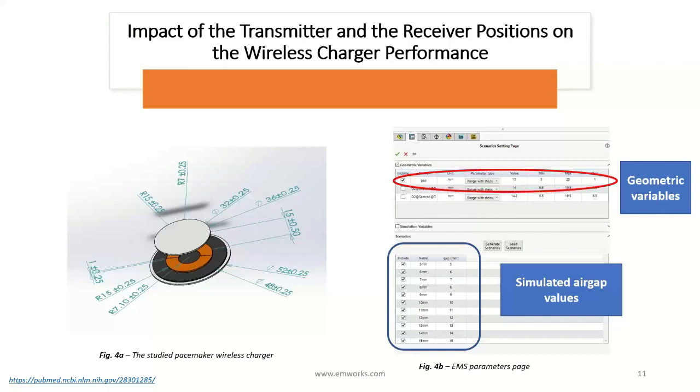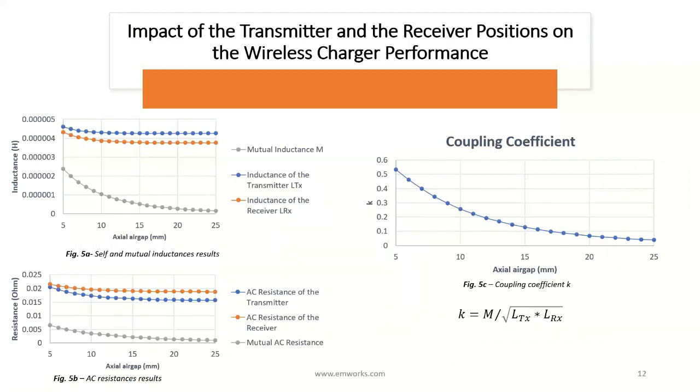The parameterization feature of EMS is used to sweep the air gap distance. The simulated air gap distances are illustrated in figure 4. After running all the air gap distances, we collected the wireless coil parameters calculated by EMS. Self and mutual inductance results are in figure 5a. The three inductance results decrease when the air gap gets larger. The same behavior can be seen for the AC resistance in figure 5b.